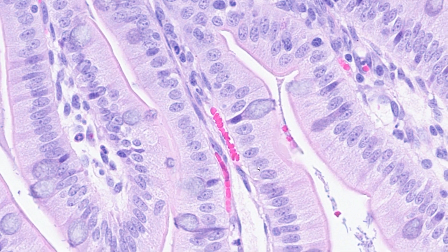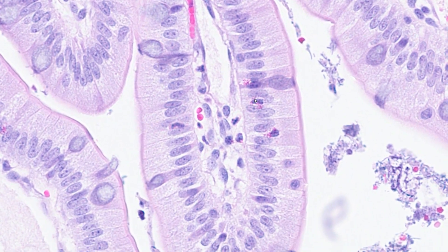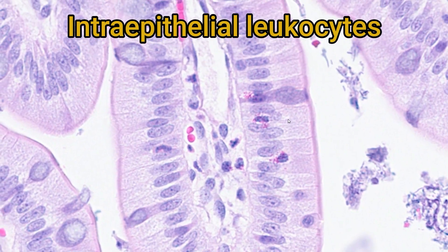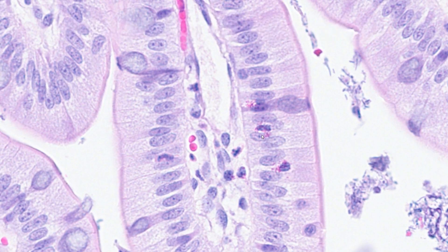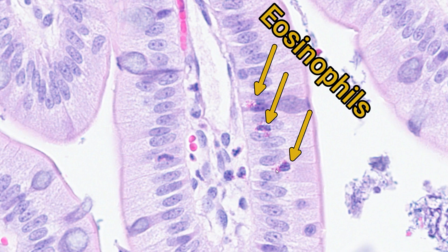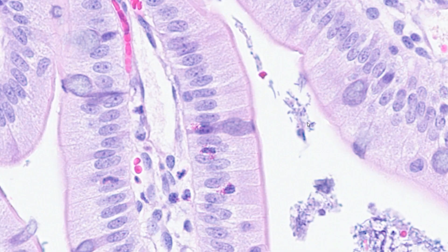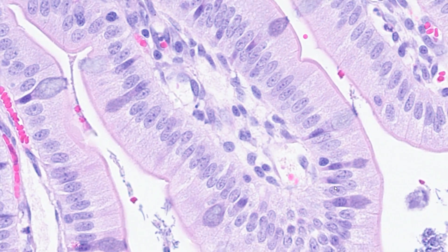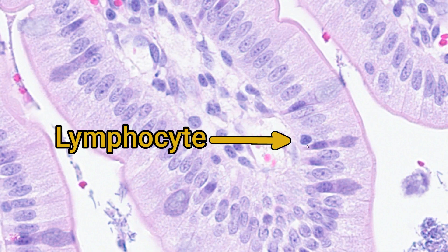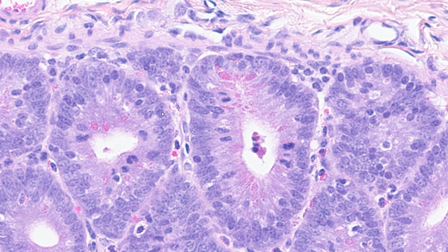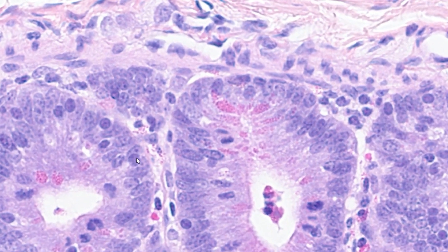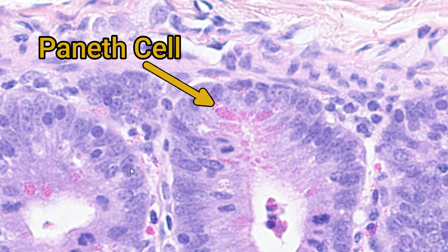Usually you'll be able to see a few other cell nuclei randomly dotted around in the epithelium. Most of these are intraepithelial leukocytes which are part of the resident immune system. For example, in this section we've got a few eosinophils within the epithelium, identifiable by their granular eosinophilic cytoplasm, and a lymphocyte nucleus also transiting through the epithelium. Going back down to the crypt, sometimes you can see another cell type: the Paneth cell. These are quite distinctive as their cytoplasm is filled with eosinophilic granules, and they secrete antimicrobial peptides forming part of the innate immune system.